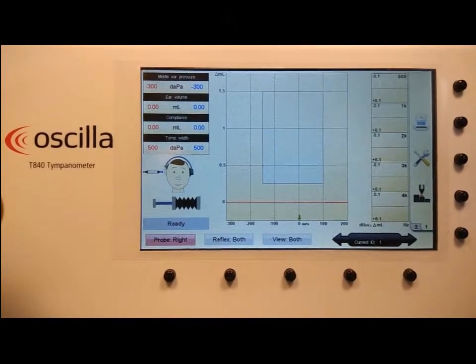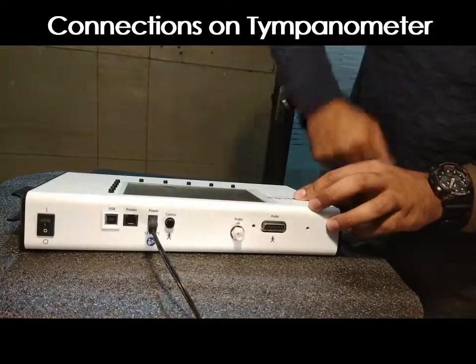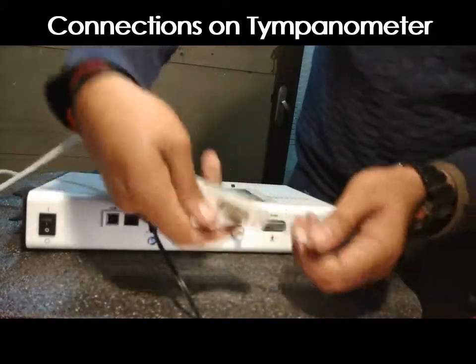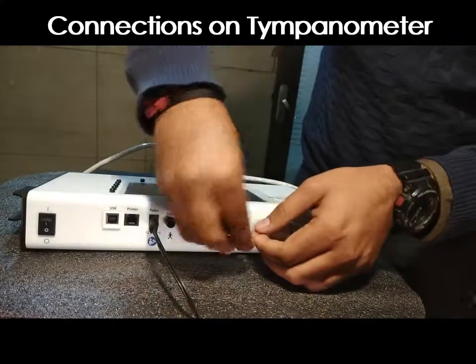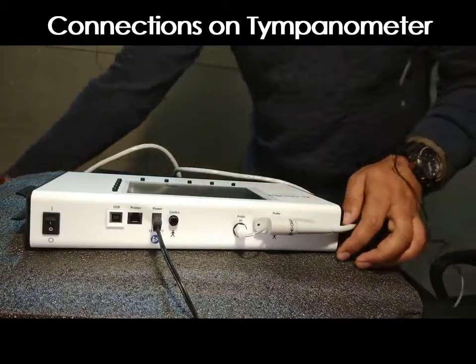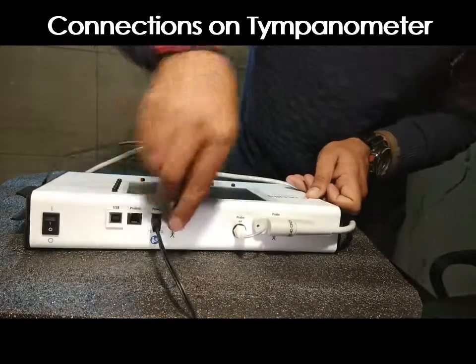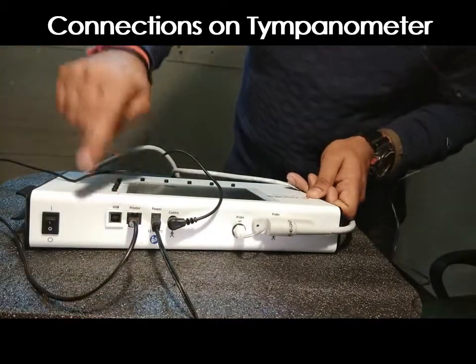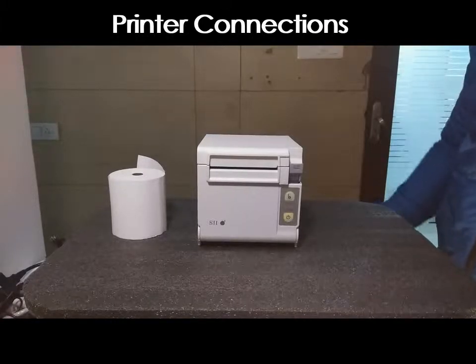Now let's make the connections. This is the power point where we connect the power adapter. This is the probe port where we connect the probe — it goes in like this. The contra headphone is connected to the contra headset port. After that, connect the printer cable to the printer port, and if you want to connect to a PC, the USB cable goes in here.